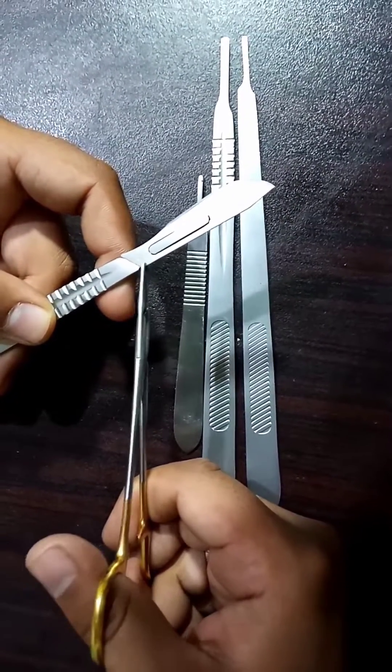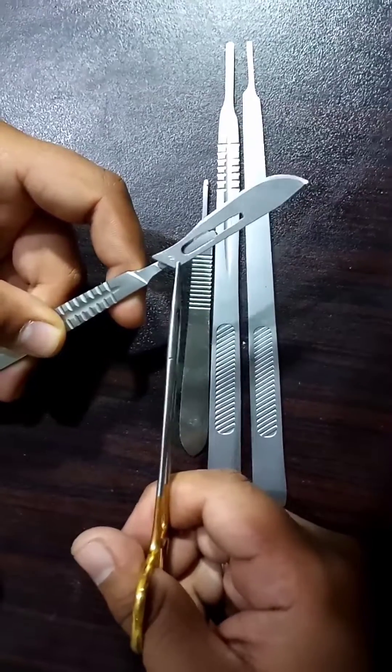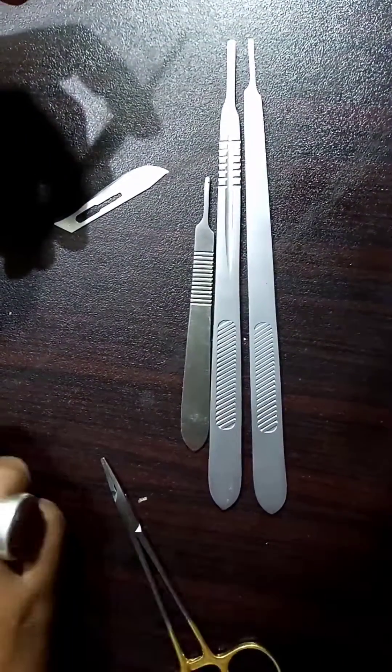To remove the blade, carefully lift the bottom of the blade until it unlocks from the scalpel handle.